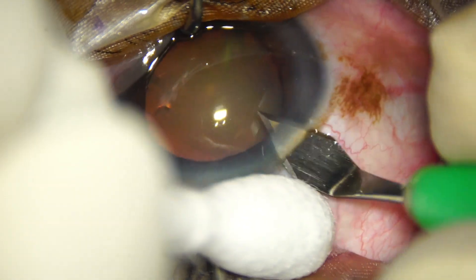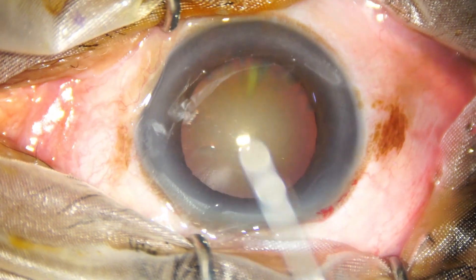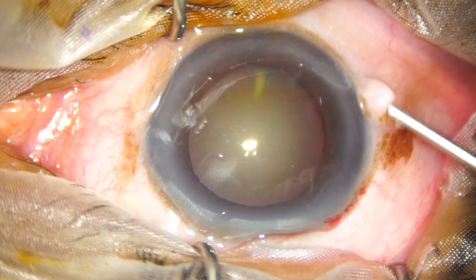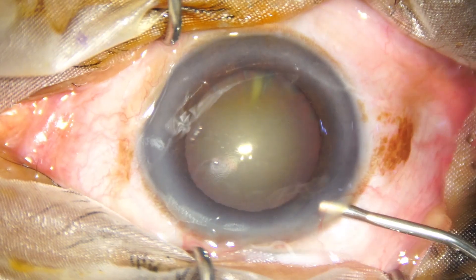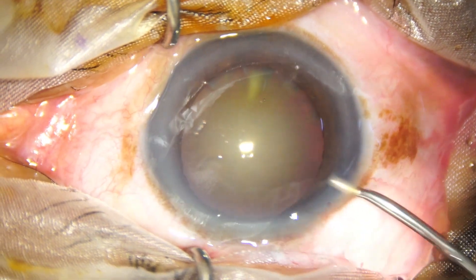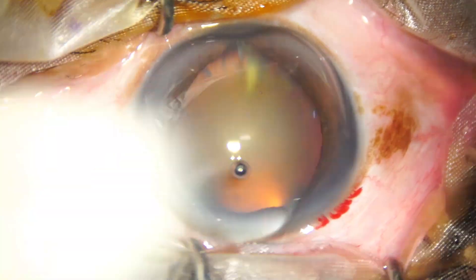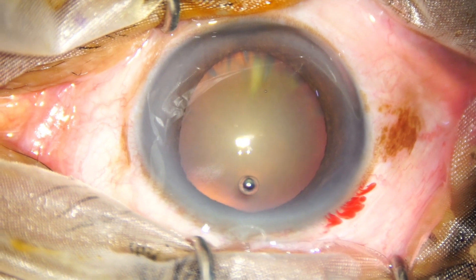This is the main wound being made with a 2.8 mm steel keratome. The anterior chamber is filled up with 2% hydroxypropylmethylcellulose, and methylcellulose is applied over the cornea for better visibility.